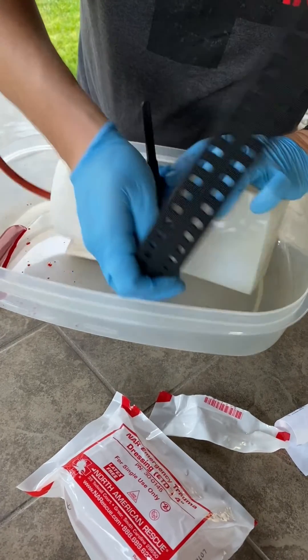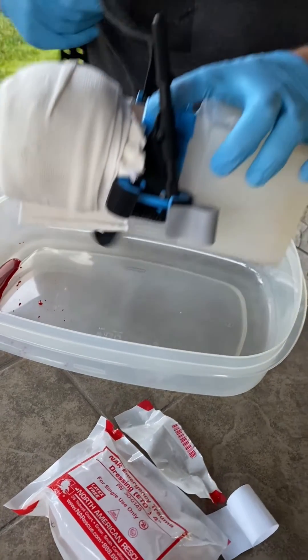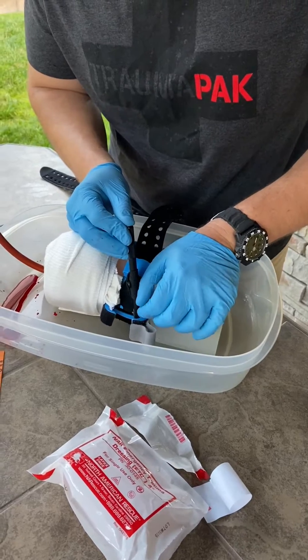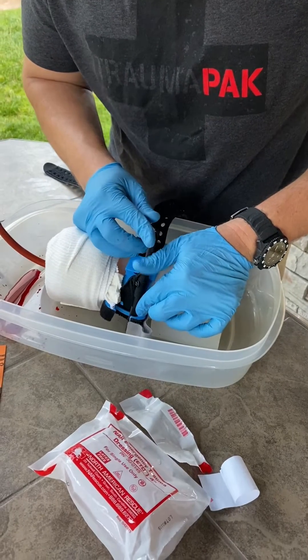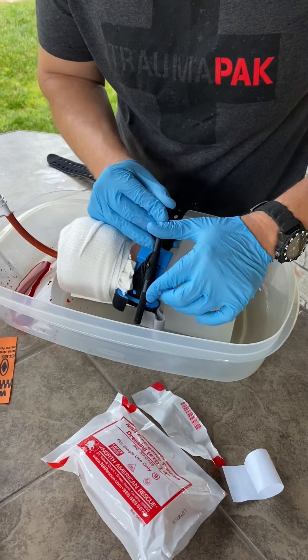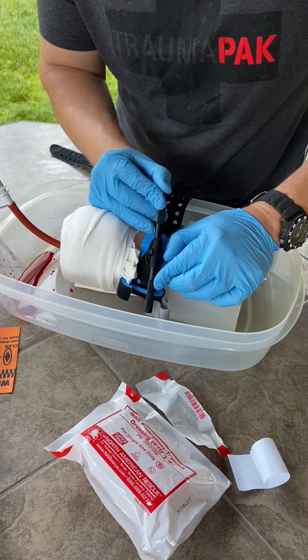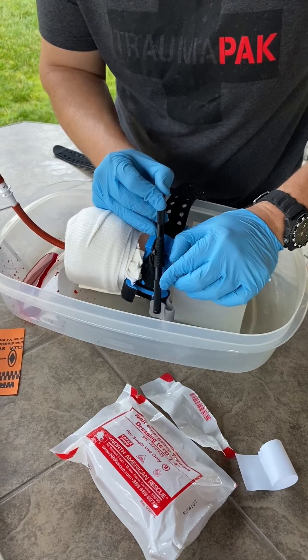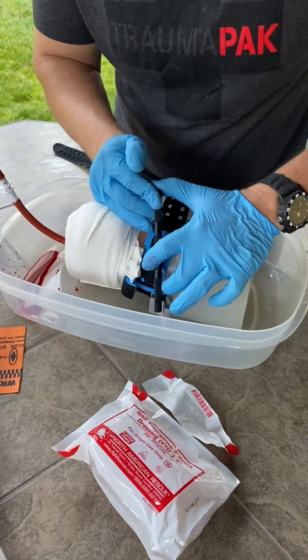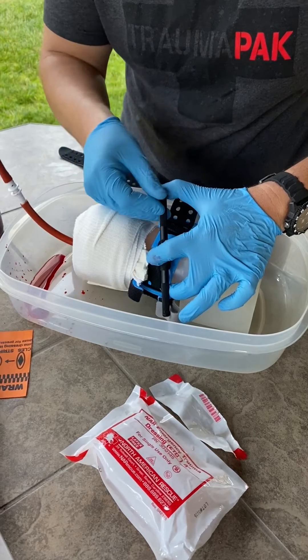Now is when we do the conversion. I begin slowly and methodically releasing the tourniquet — not removing it, but simply and under control releasing the pressure on the windlass rod. I want to do this over about one, maybe two minutes, and during this time I'm really paying attention to the circulation and perfusion of that extremity. For example, if it's the arm, we're looking to see if color is coming back to those fingertips and to the arm itself.